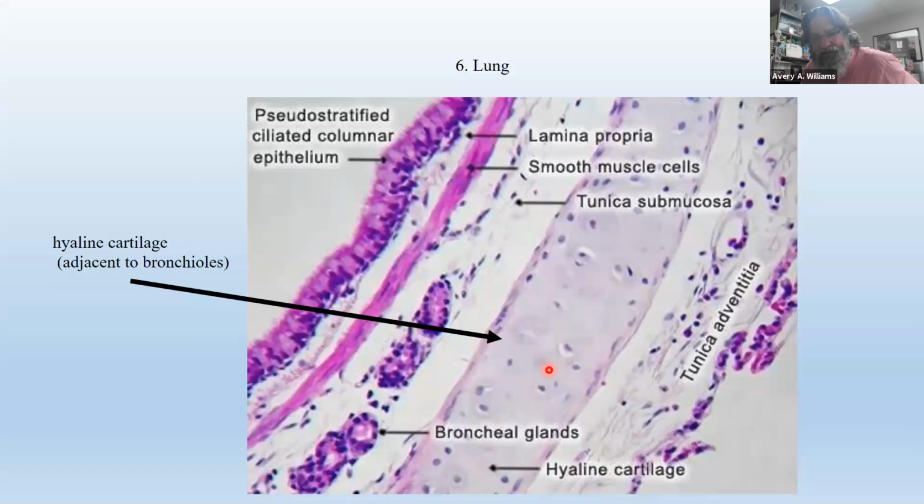And you see the little pits and the dark staining structures inside the pits, or the actual cartilage cells. So those are the chondrocytes and lacunae. All cartilage has chondrocytes and lacunae, but only hyaline cartilage is fiber-free. There's no fibers in it whatsoever. Hyaline cartilage is translucent matrix.